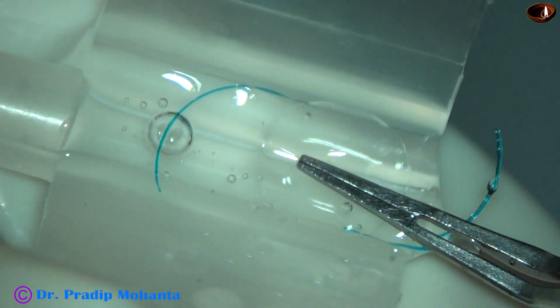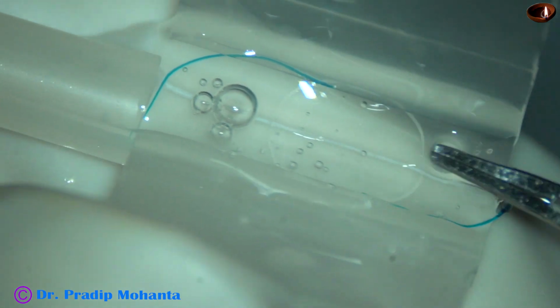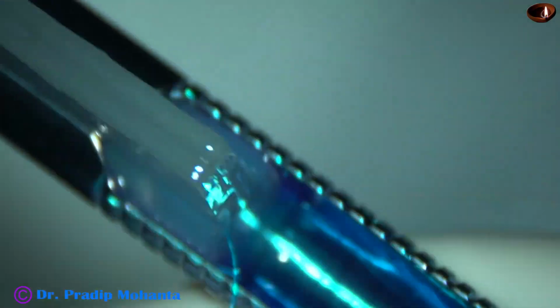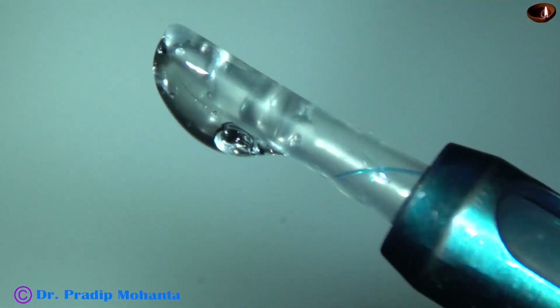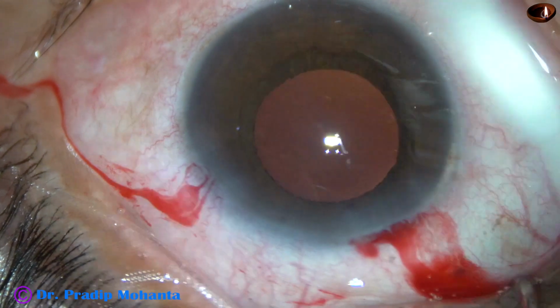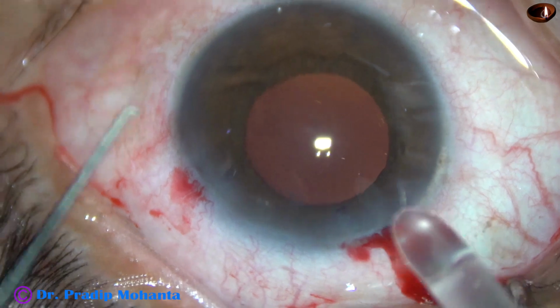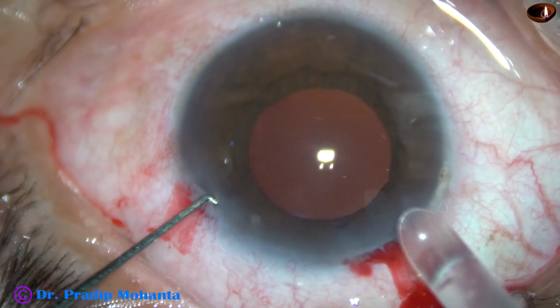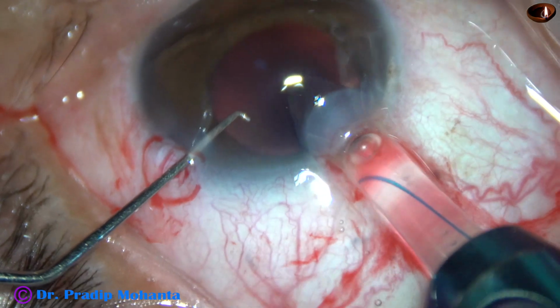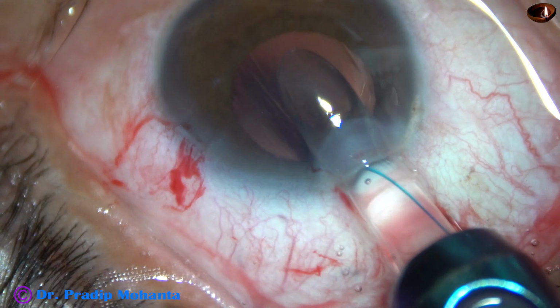And this is how we fold the lens in the cartridge. The leading haptic goes this way. The lens is folded and the piston pushes the lens a bit forward, and now the tip of the cartridge goes into the anterior chamber and the intraocular lens is screwed out.